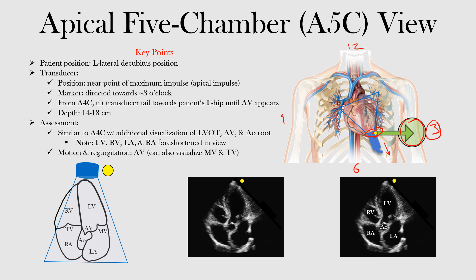The transducer is at the apical impulse, and from the apical four-chamber view, all you want to do is tilt the transducer towards the patient's left hip — down here on the left side — and tilt until you can see the aortic valve starting to appear.